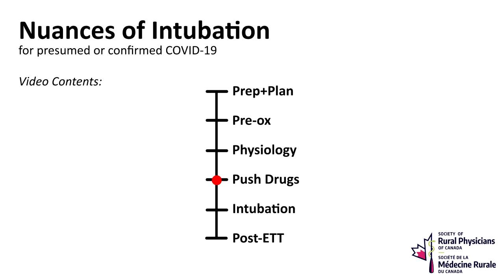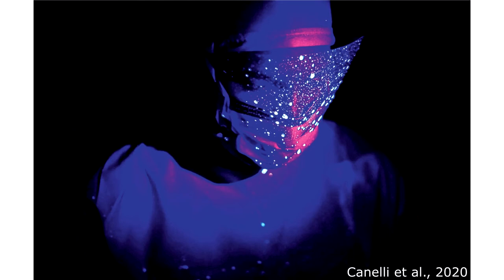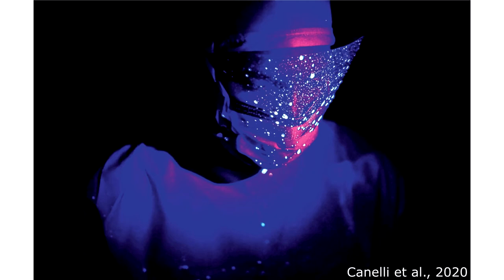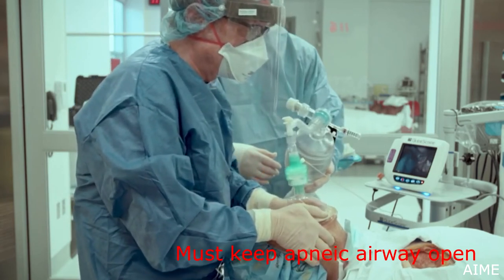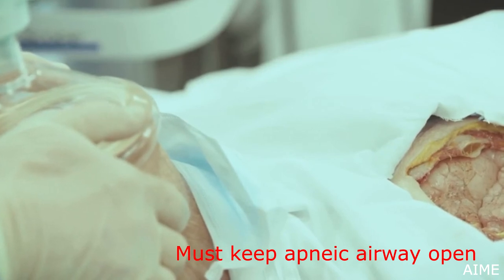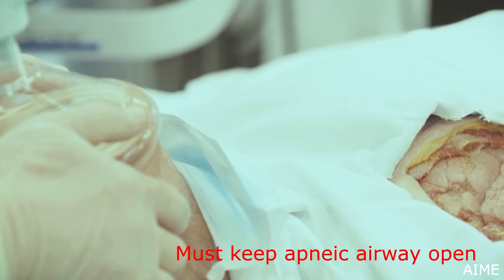There are a few nuances of the apneic period in COVID patients. If paralysis is used, you should wait at least 60 seconds for confirmation of paralysis. Some video laryngoscopy monitors have timers on them that you can use, but the idea here is to avoid getting coughed on. Remember that when they become apneic, you may need to give them an aggressive jaw thrust to keep the airway open if you are using the protected CPAP approach discussed in the last video. In order to accomplish this, if you are using a non-invasive positive pressure mask, you might need to switch to a regular cuffed seal mask to allow you to do this well.